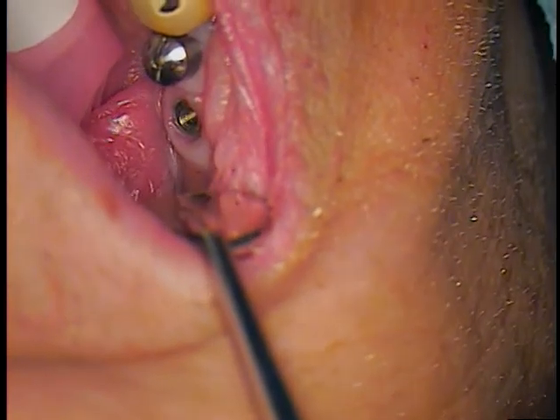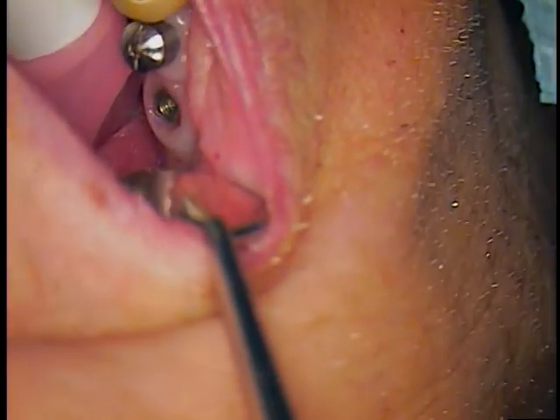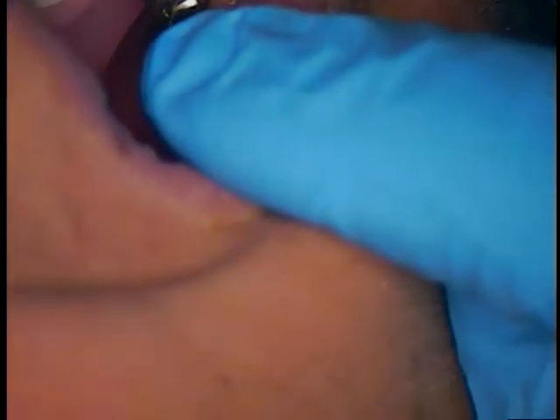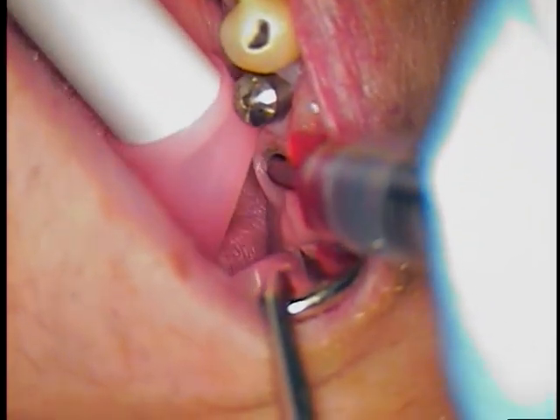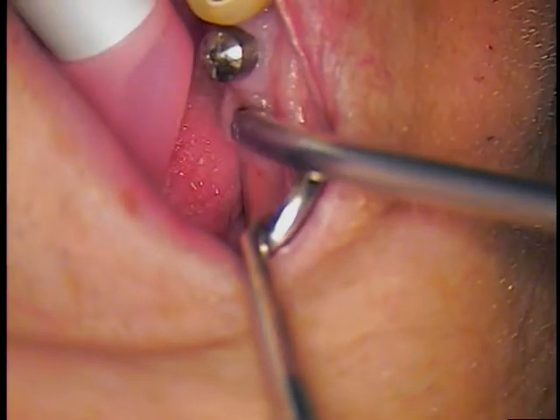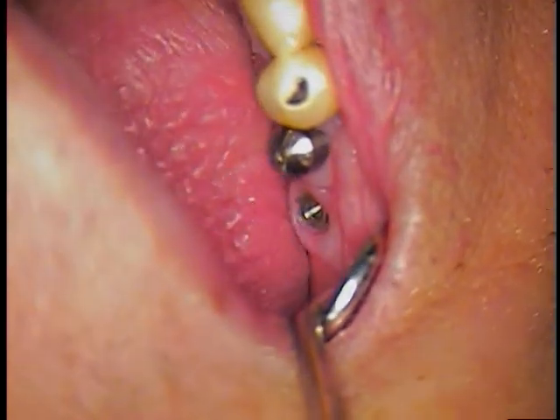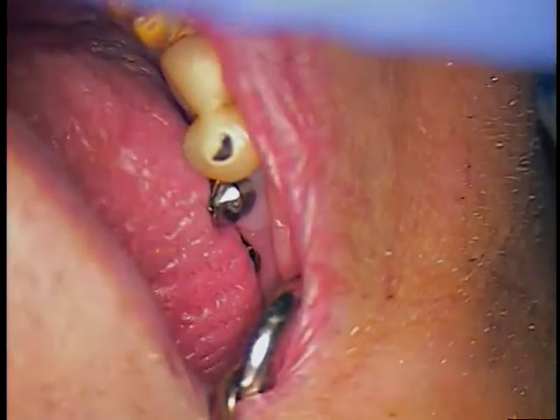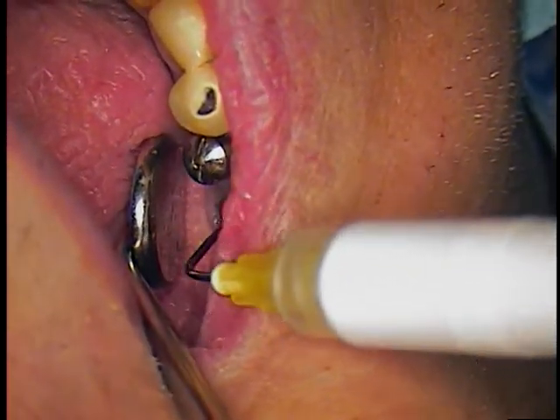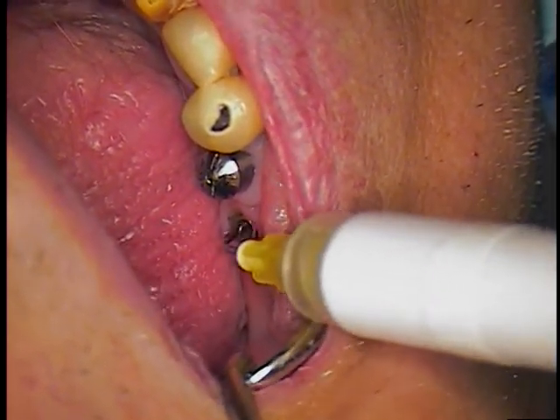Let's see if I can get that to come up. That's really hard to tell down there. I need another cavity cleanser syringe. They all have to be turned. Let's vacuum that out — micro suction. That should be squeaky clean in there. I'll look down inside.